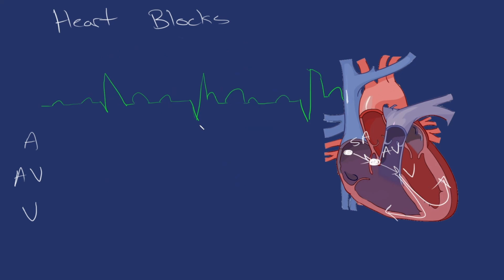So this next one looks pretty weird, and we have to draw this all out again. So we're going to start with the P's. You see a P here, P here, P here, P here, P here. And there's a weird one that's tucked up in here, and you see this weird shape that's unlike these other morphologies. So we can assume there's actually a P here, and there's another one that's buried up in here.